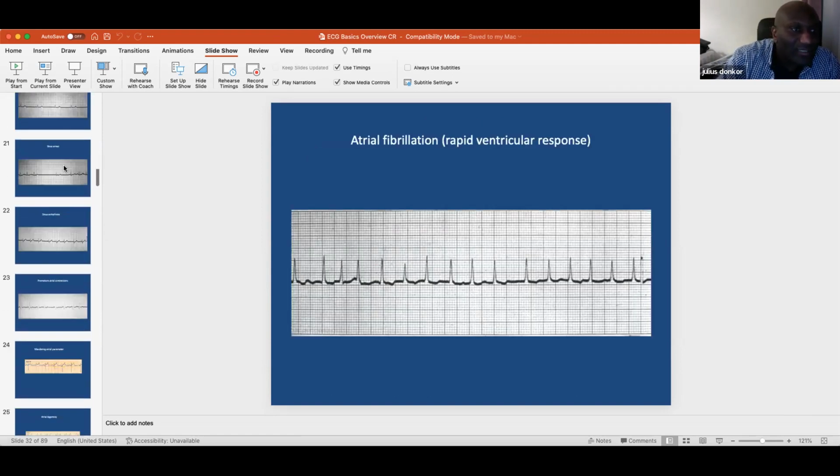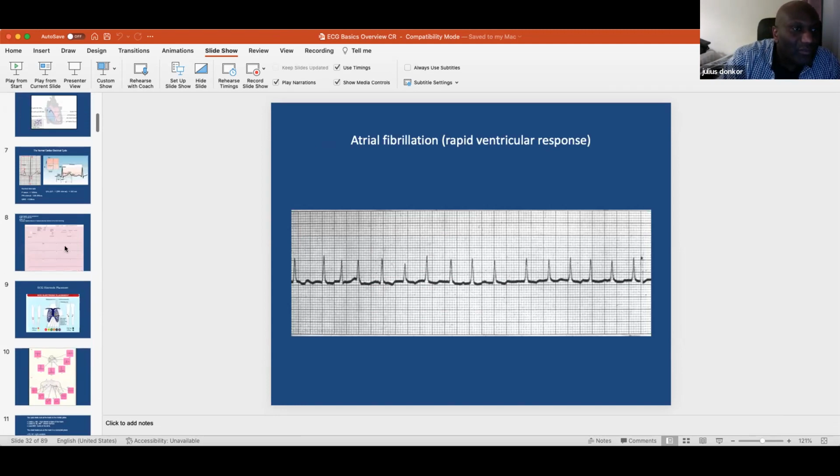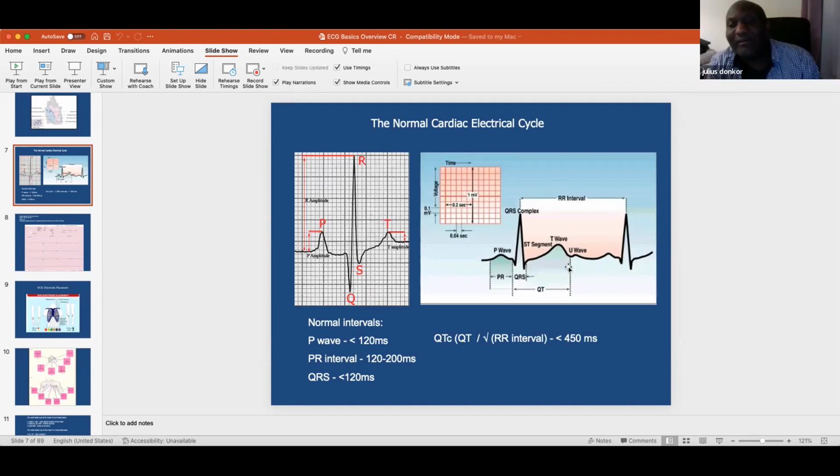If I can get a classic one to show you. So the initial portion will have a lesser gradient than the terminal portion of the T wave, if you like. The upslope will be having that. So you look at things like components of the QRS or the ECG like that.